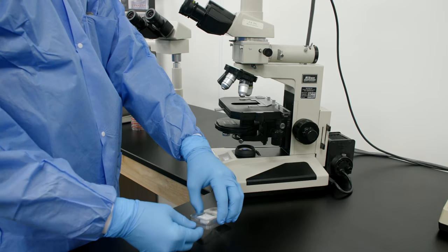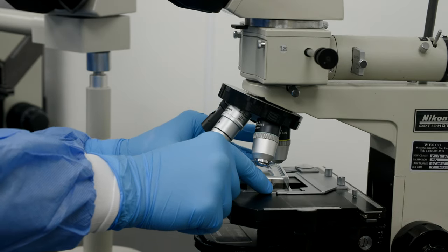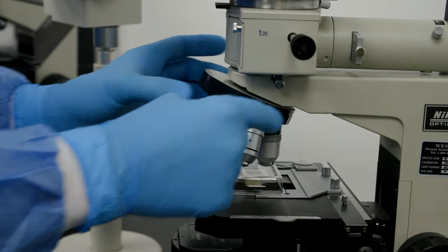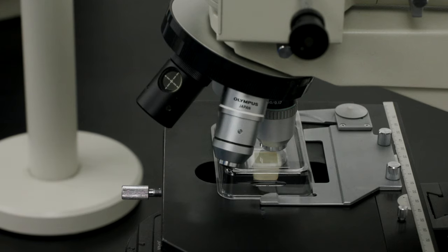To examine growth, remove the cover and place the entire unit on the microscope stage. Examine the culture at 400 power, which is the high dry objective lens. MicroView can be examined as often as you like without disturbing the delicate fungal structures.